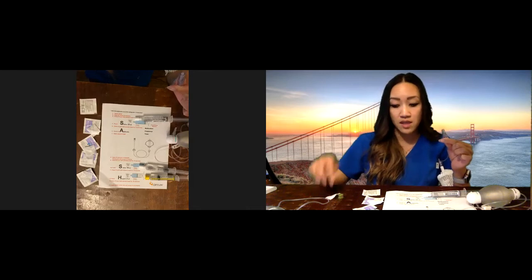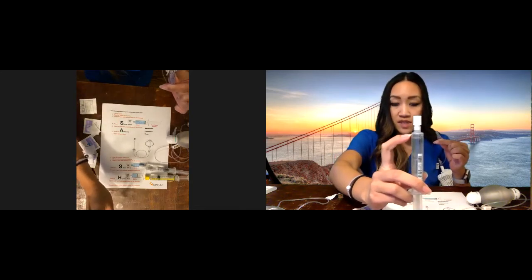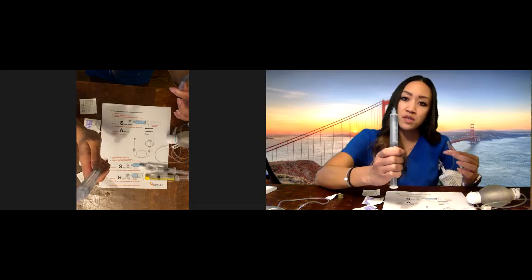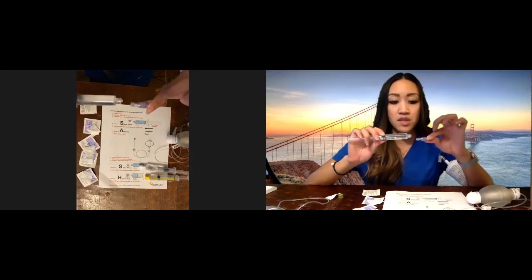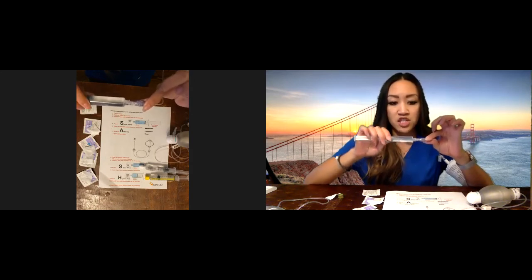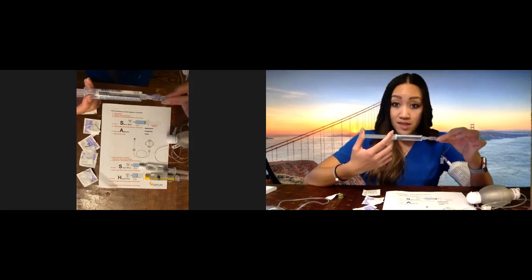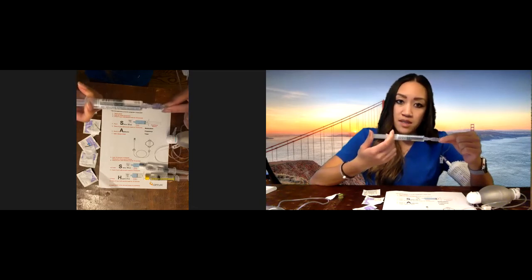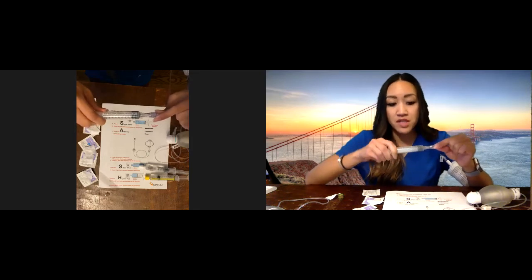Number four, we're going to flush with saline. Take your first flush — you can see there's an air bubble in each flush. Unscrew the cap and squirt the plunger all the way up until you get rid of the air bubble. Then connect your syringe to your port using the push and twist method — you have to twist to lock it in. After that, flush using the push-pause method: push, pause, push, pause, push, pause. The flushes can be given pretty fast. When you're done, disconnect.